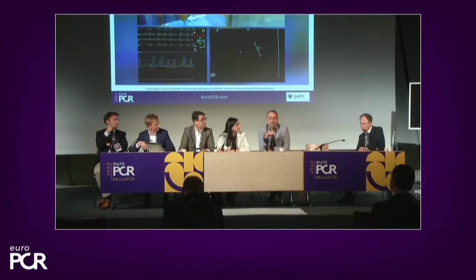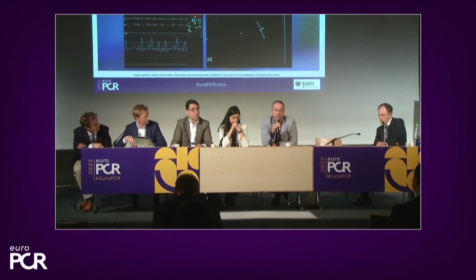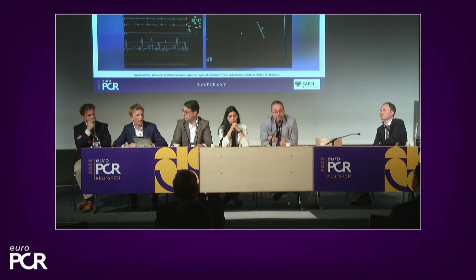Perhaps usually in these high-risk patients, we're looking beyond in-hospital outcomes at the 30-day outcomes for severe events, mortality or something like that. It's somewhere in the range of 1 to 2% in very high-risk patients. It's worth mentioning that the patient that I presented is a patient in cardiogenic shock on inotropes. It's still a safe and predictable procedure and very, very hemodynamically benign. And actually, if you look at the commercial data that you presented a second ago, the risk of mortality or conversion to surgery in the commercial data set during the procedure is 1 in 1,000, which is a very, very low risk that we can tell our patients.